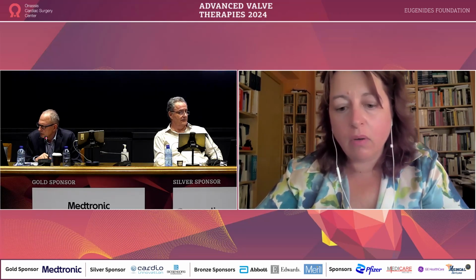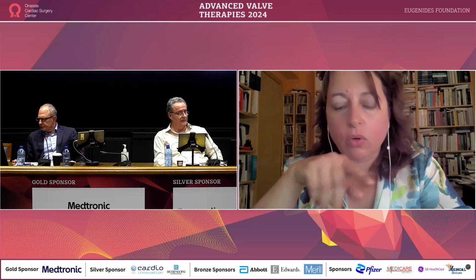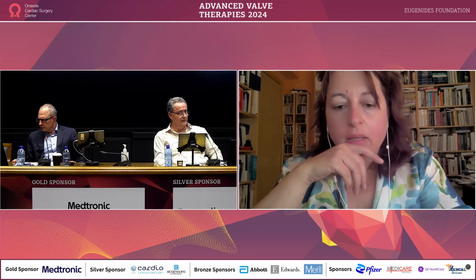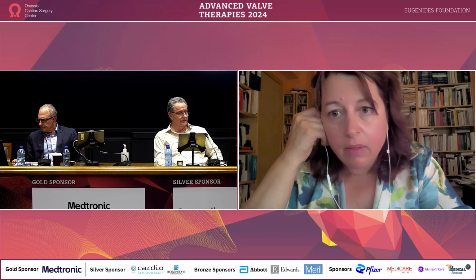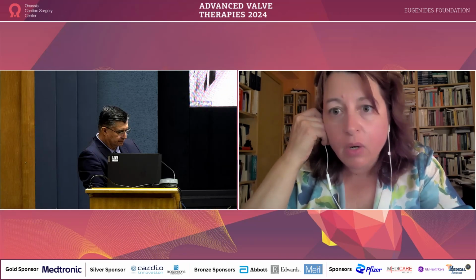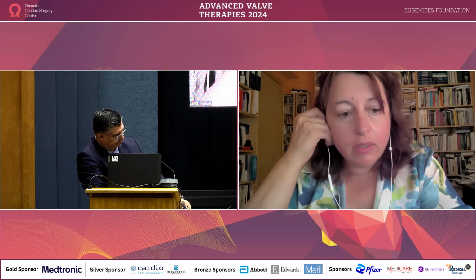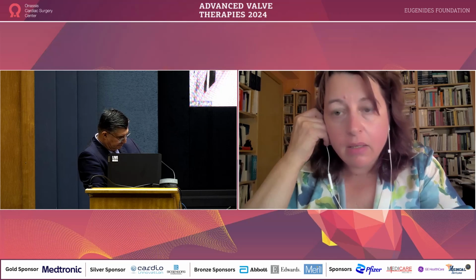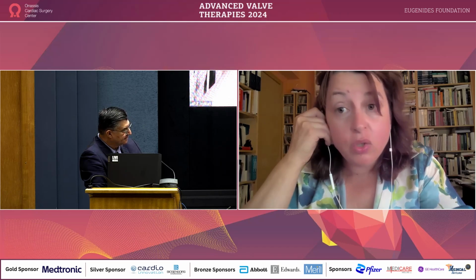Dr. Nyktari should make a comment, I think. So, first of all, congratulations to all the presenters for the high-quality presentations they made. Going back to your question, probably echocardiographers who are working very close with interventional cardiologists who put transcatheter prosthetic valves are more familiarized to what you need.